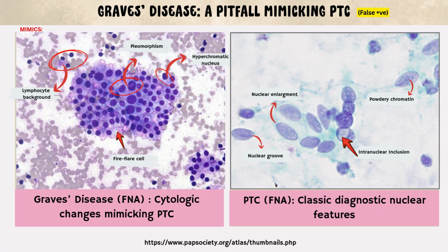So, Graves' disease mimics papillary thyroid carcinoma through reactive nuclear atypia. However, papillary thyroid carcinoma should only be diagnosed when the requirement of classic nuclear features is present, together with appropriate clinical correlation, in order to avoid false positive diagnosis and unnecessary treatment.